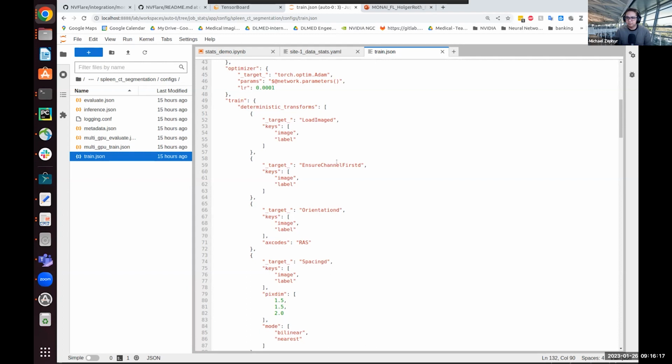And again, maybe doing some of that exploration beforehand to make sure it's the right classes that you're actually labeling, and that the institutes use the same categorization for everything as well. And what does the actual distribution of things look like? So I think that's another thing to consider, that it's probably applicable all throughout the process as you're looking at an experiment.